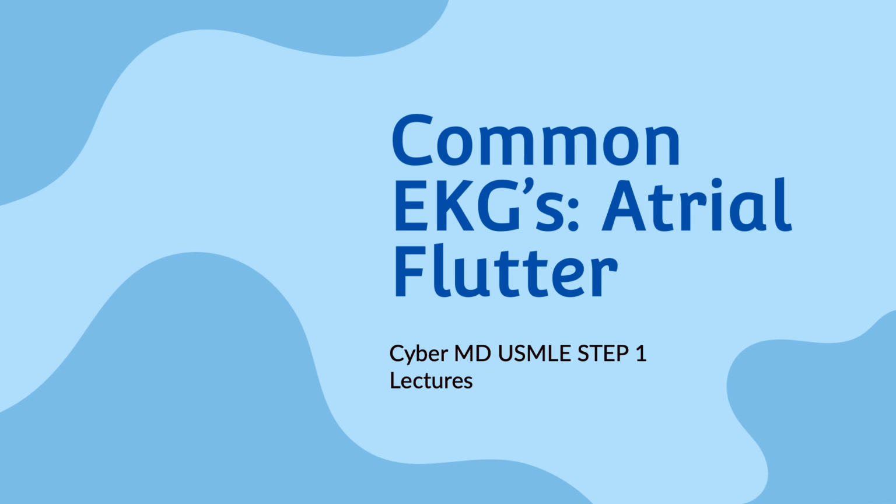In this lecture, we'll be covering atrial flutter. Atrial flutter is a type of cardiac arrhythmia that affects the upper chambers of the heart, the atria, and is important to understand as a part of your USMLE STEP 1 exam. You should be able to recognize this in clinical practice as well. Today, we will be delving into the details of atrial flutter.